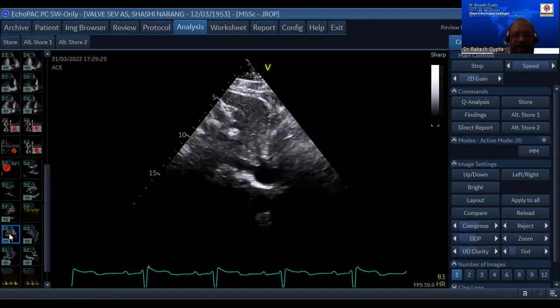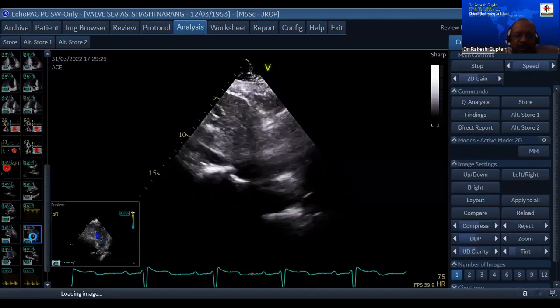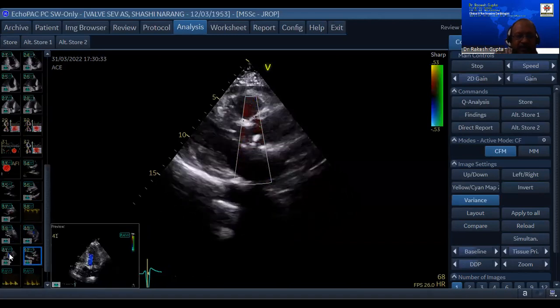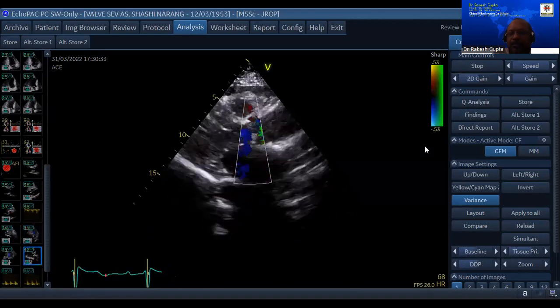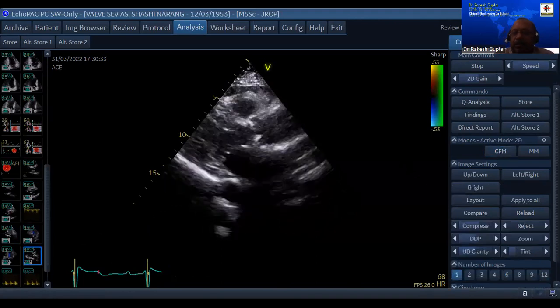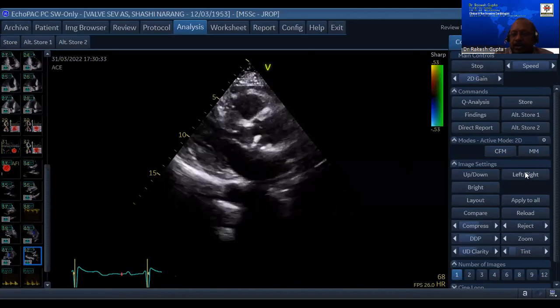So let's leave it at 5-chamber and 3-chamber for all of you. That'll be reasonably fine. If you do it, that'll be more than enough. Okay, now I'm going to measure this aortic valve LVOT diameter better in this particular image. Just give me a second.